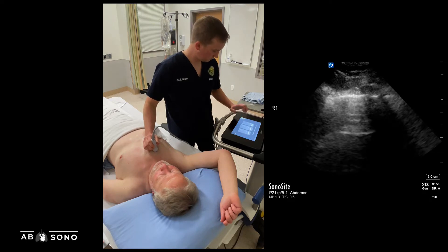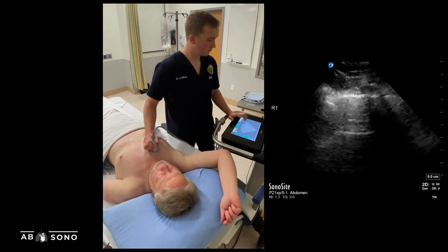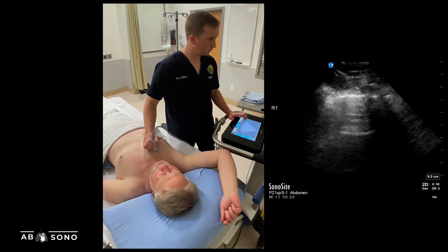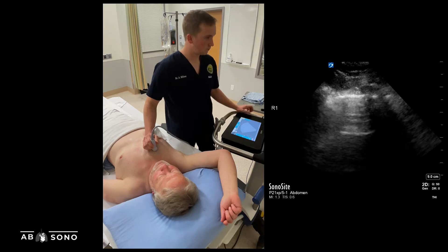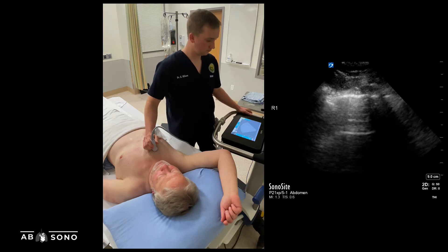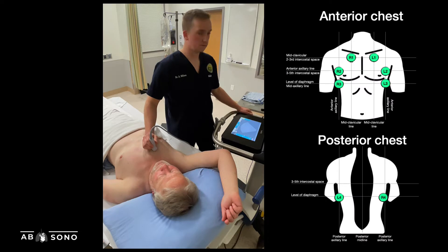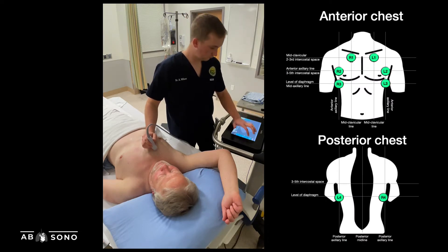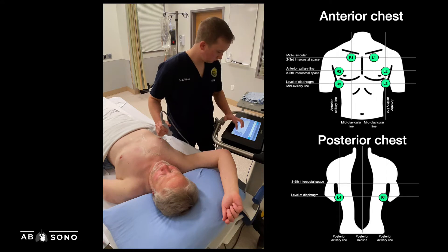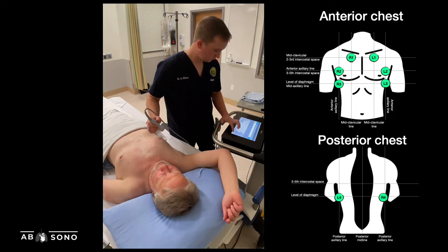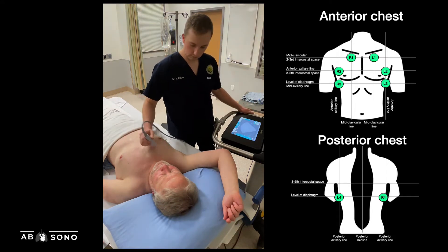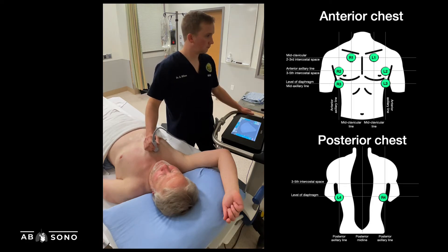Various protocols exist for lung ultrasound, with many point-of-care users employing a method that interrogates four to six regions of each hemithorax. We'll describe the protocol used by the CCUS team, in which images are acquired from four zones on each hemithorax. It's very important to ensure your images are labeled at the time of acquisition, because unlike bedside echo, it can be next to impossible to determine the anatomic location of unlabeled images at the time of reporting.